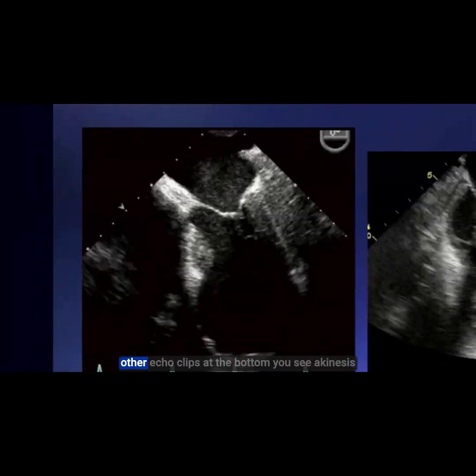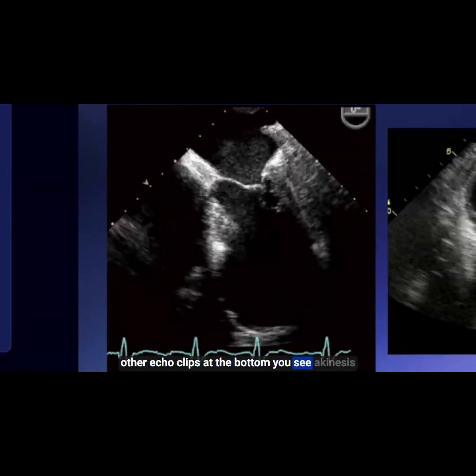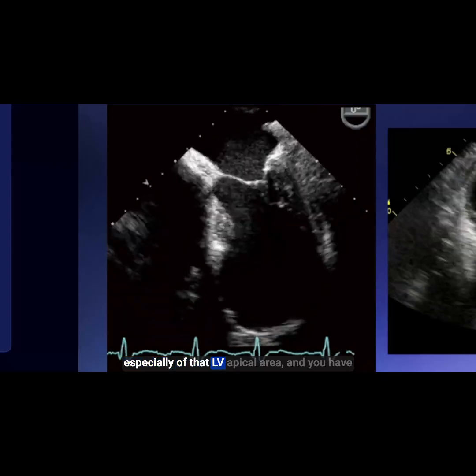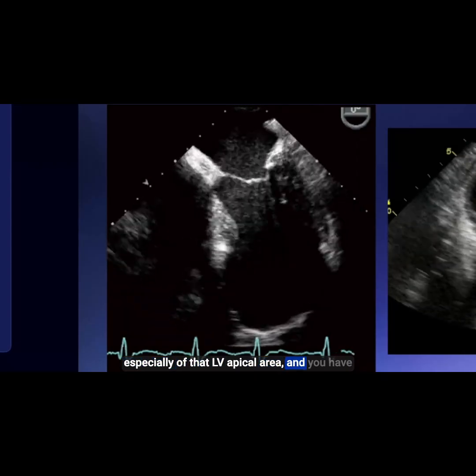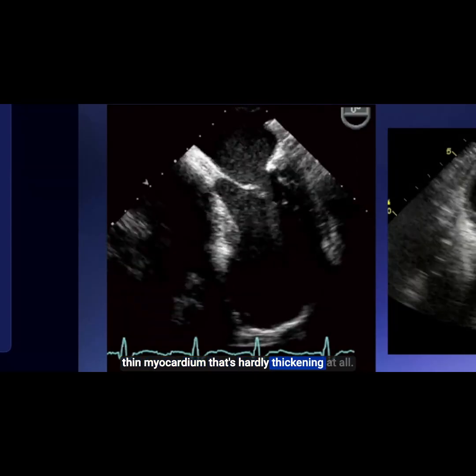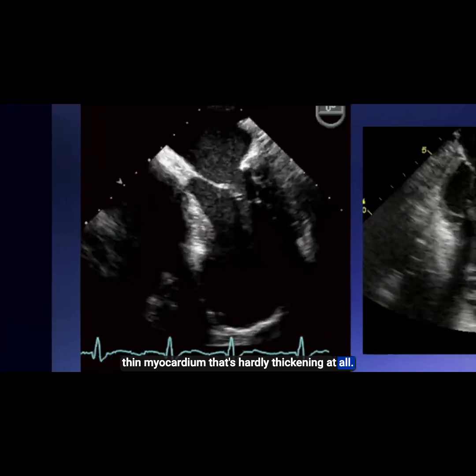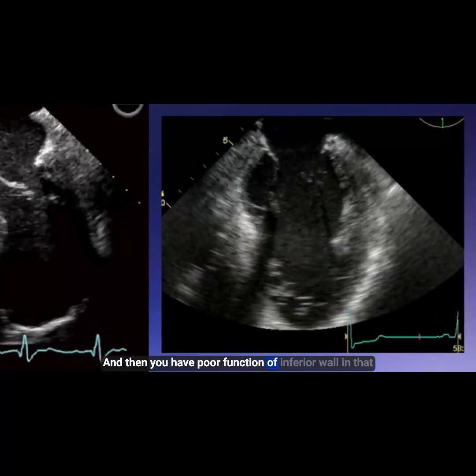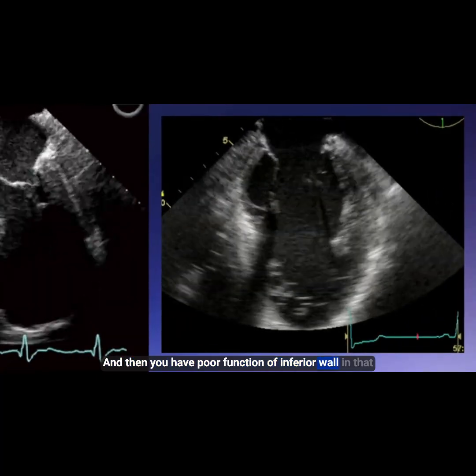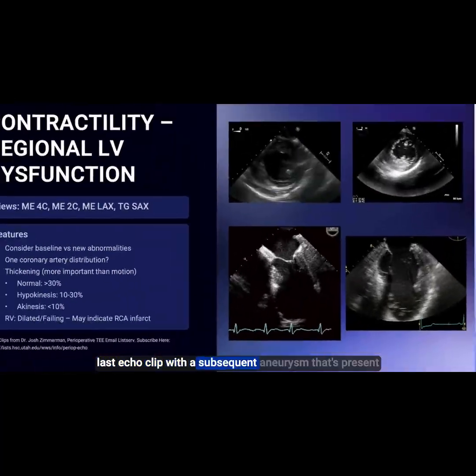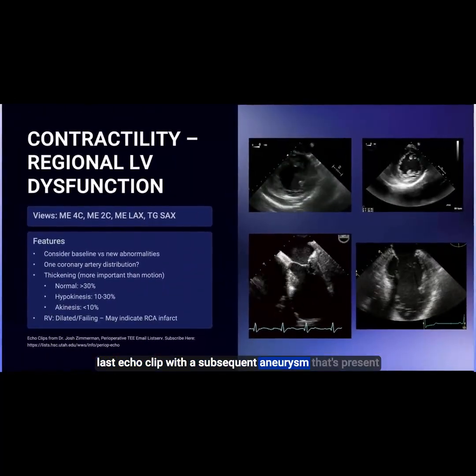In these other echoclips at the bottom, you see akinesis, especially of that LV apical area, with thinned myocardium that's hardly thickening at all. And then in the last echoclip, you have poor function of that inferior wall with a subsequent aneurysm that's present.